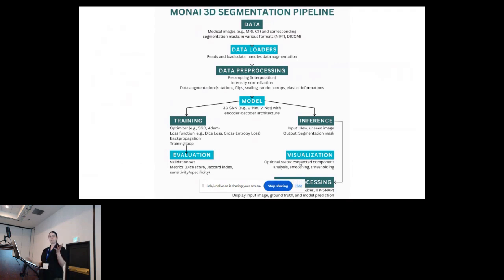So we have our model and we have our annotations, labels created, and we feed that to the model, and we train it so that when we give it a data set which doesn't have any label or any masks, it will create masks for us.